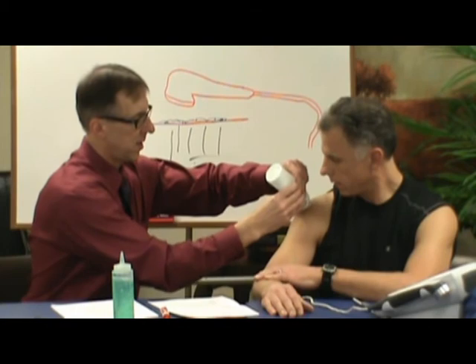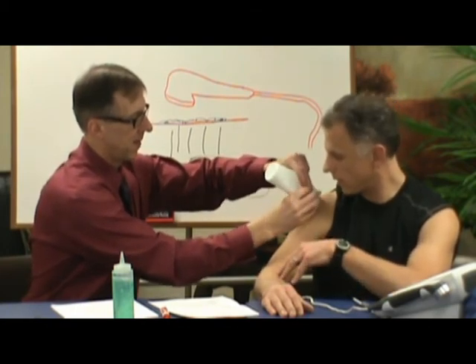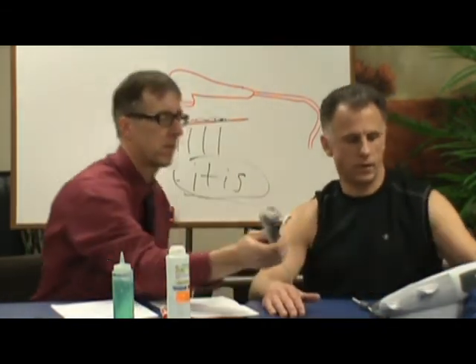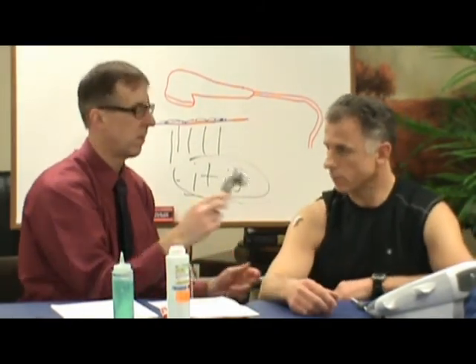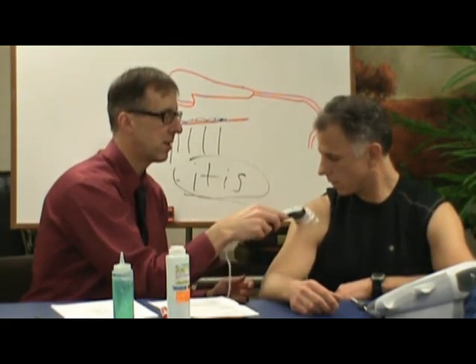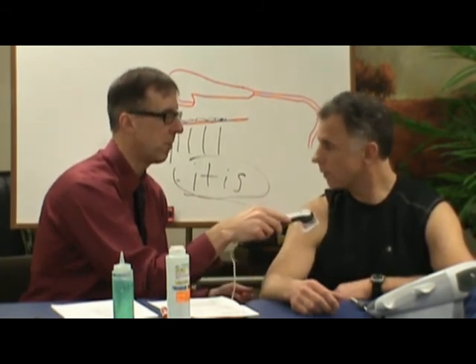I'm just going to squeeze it on. It's usually a little cold. Sometimes you may be lucky and the therapist has their product warmed up so it feels good, but it's not a big deal. It's just cool for a little while. So anyway, it's very simple. We're just going to start the machine, put it up to the correct intensity, and then just a slow rub like this. Generally you are probably not going to feel much of anything.